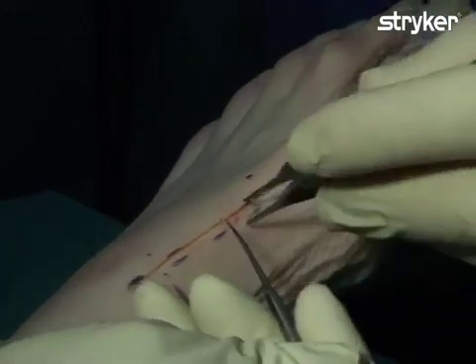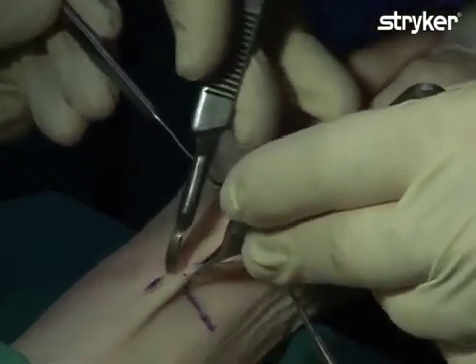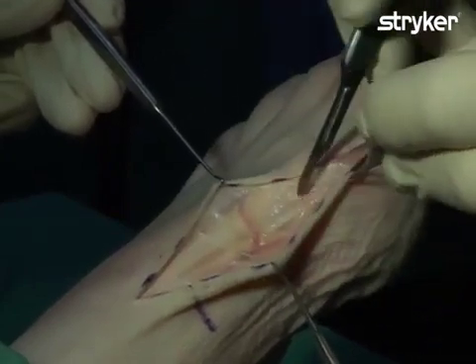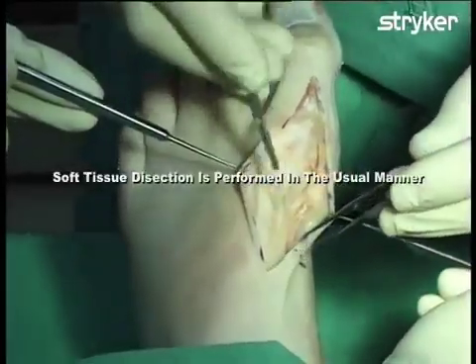The skin incision is then made. Retractors are then used to expose the underlying structures. Soft tissue dissection is then performed in the usual manner.